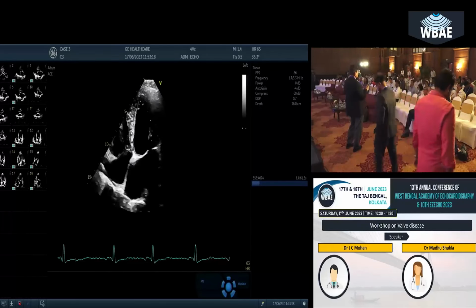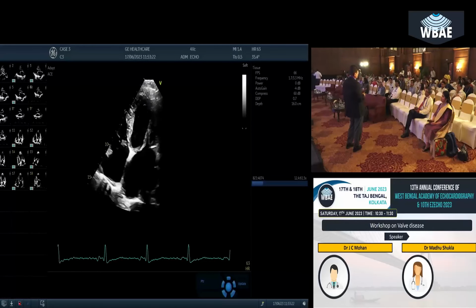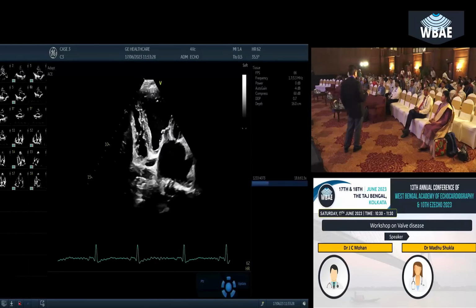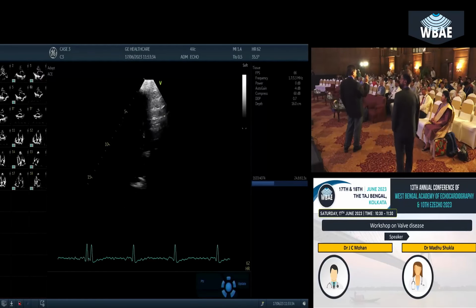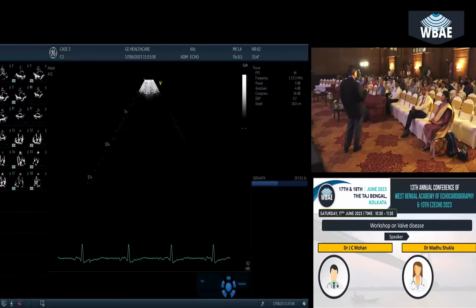The angle is actually obtuse. So they are not really at 180 degrees. That is why you have to measure LA separately for volume and LV separately. And that is a little cumbersome. Previous studies measured LA volume and LV in the same four chamber view, and that is why there are discrepancies. So we are trying to rework the whole thing.